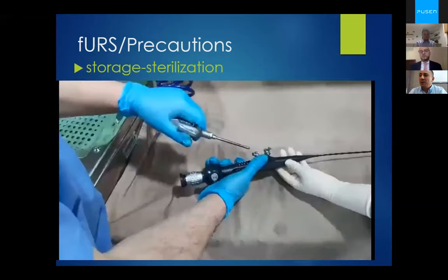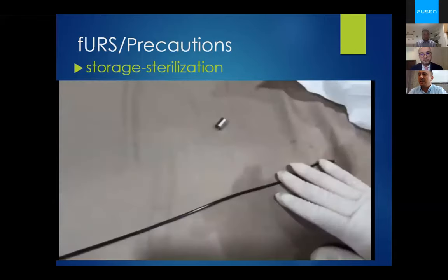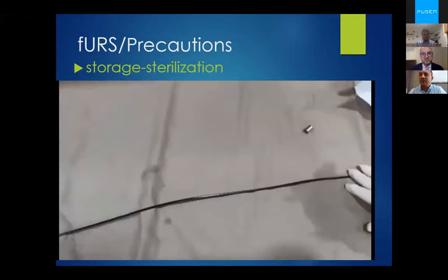Here we wash the working channel after the procedure. We can use compressed air here to keep it permeable and clean. You see here.